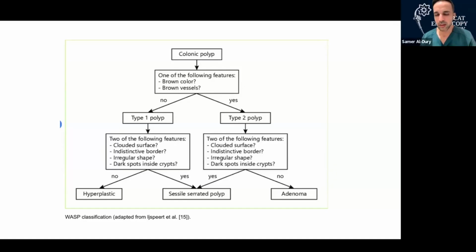If I have fluid pooling on the left side of the screen, why do I still have mucus on the right side? Then once you wash it a little bit, you see that something might be hiding there. So it really helps to follow the mucus.